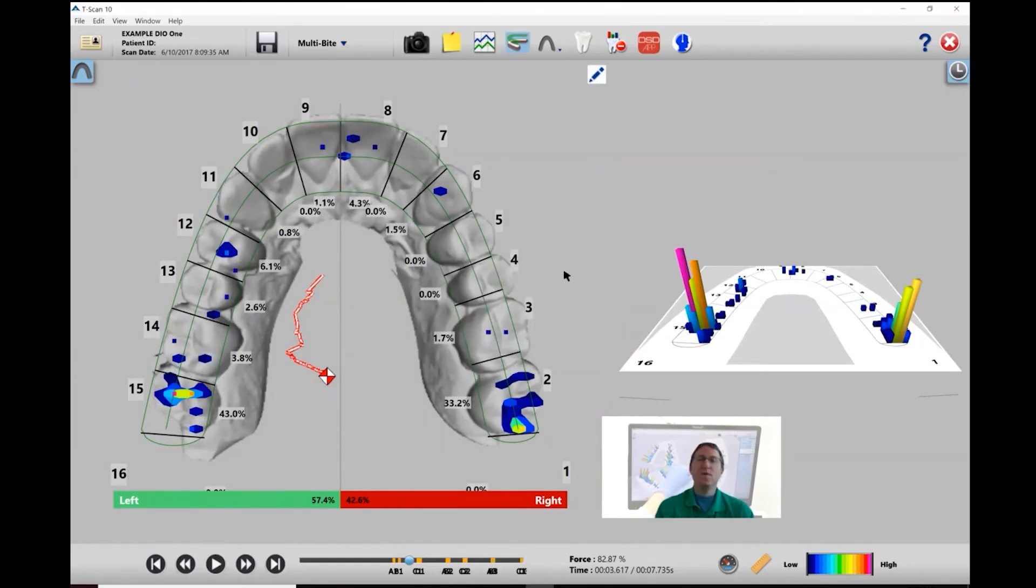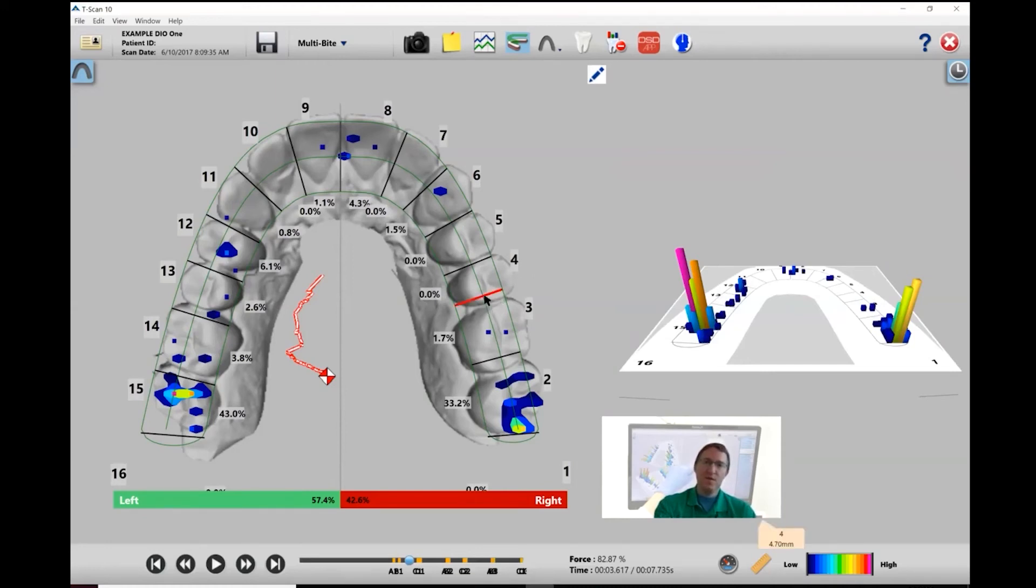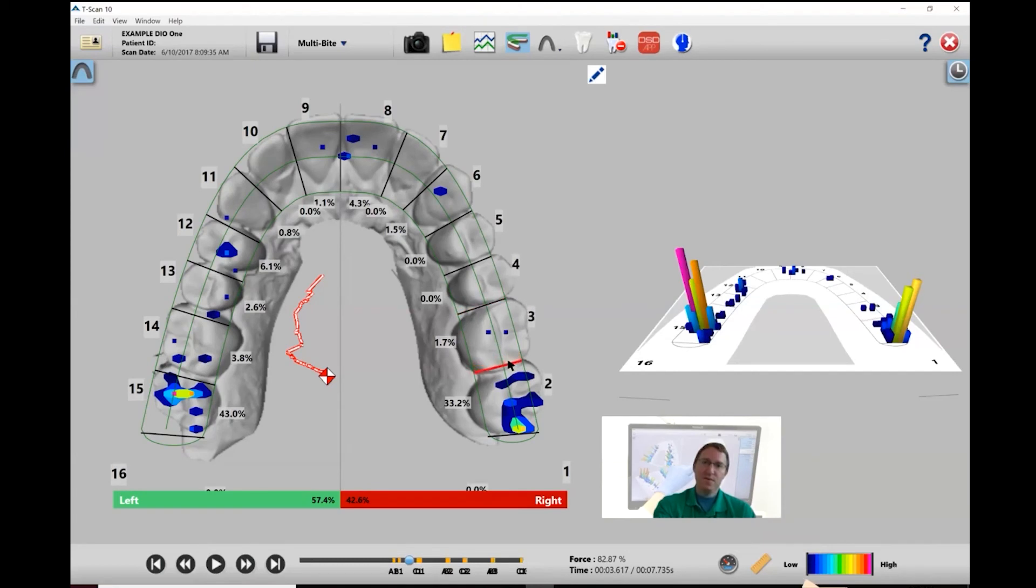And one last tip, now that you've properly aligned the digital impression, you can maneuver these black lines to give you the proper tooth width from one to the other. To do that, just left-click on the black bar here, position it to where it lines up between, in this case, between three and four. Do the same thing for two. And now you have the proper tooth width between each black line as well.